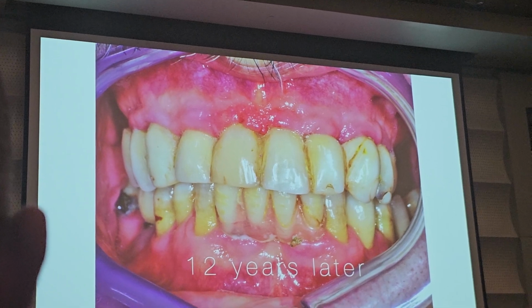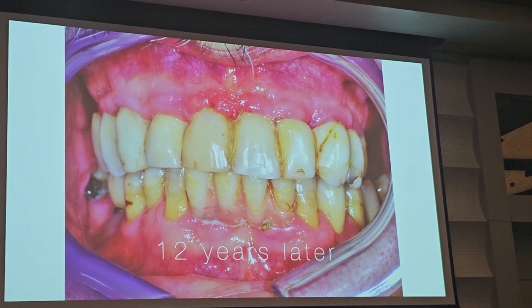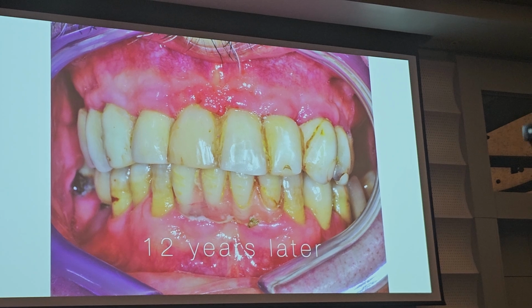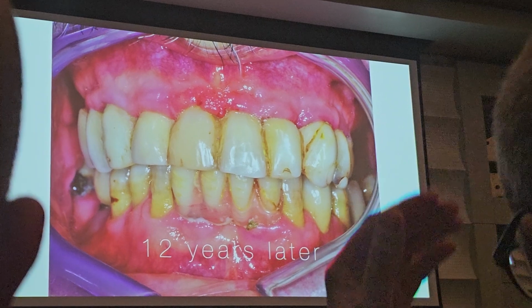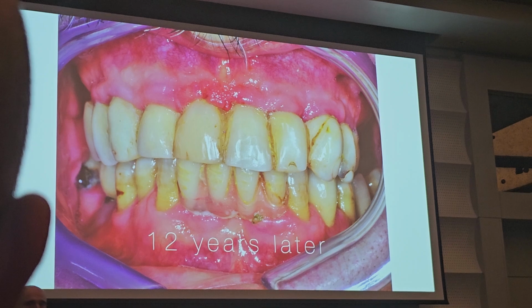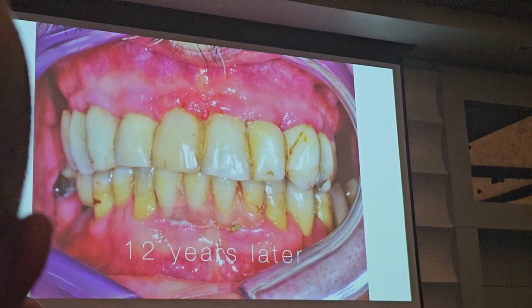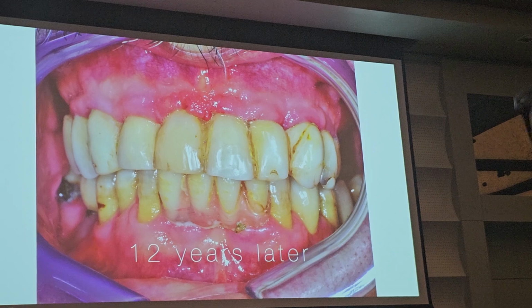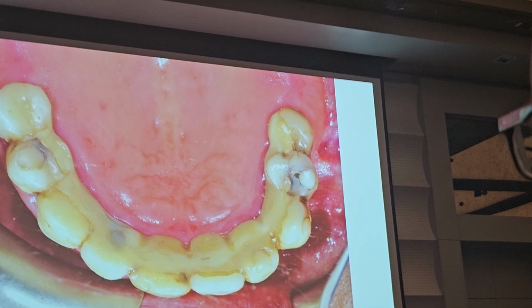This is another case, another banzai, this is twelve years later. So the patient is happy, that's the strange thing. In this case, we tested, because at that time the brand marketed some veneers for full arch cases. Okay, so what did we do? We did a metal framework, we put some composite, then we glued these veneers. But the veneers started to detach every two weeks. So what I did, I made a hole in the veneers and bonded one and then the other. Look. But the implants are still there.